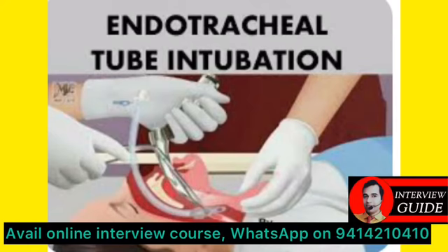After removing the laryngoscope blade, we ask the assistant, nearby person or staff nurse to remove the stylet present in the tube. After removing the stylet, we have to check whether the tube is in the proper position or not. For checking the tube, there are different things. We can check clinically by auscultating the patient's chest on both sides, and an equal entry of air on both sides suggests proper position of the tube.